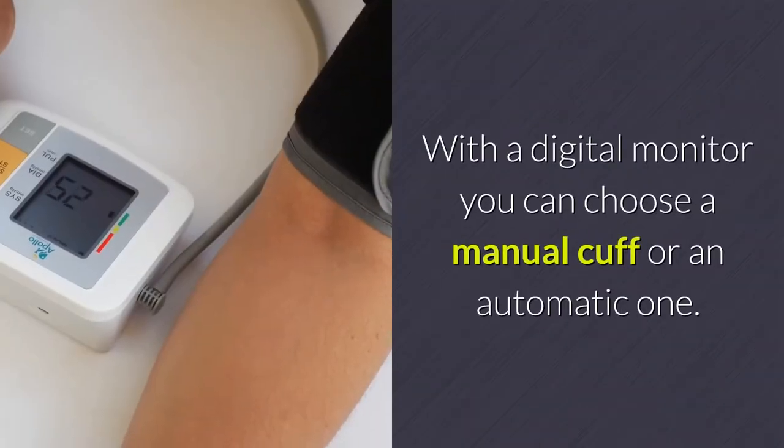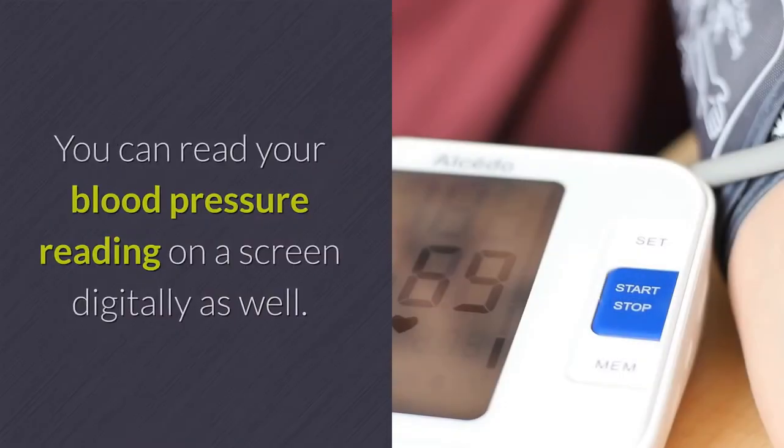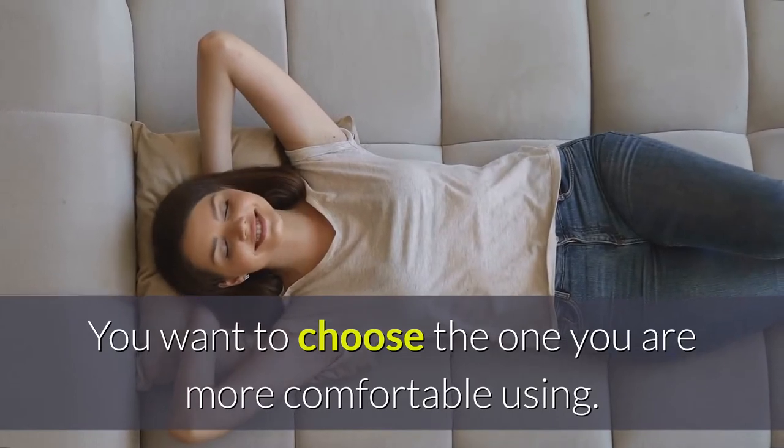With a digital monitor you can choose a manual cuff or an automatic one, and you can read your blood pressure reading on a screen digitally as well. You want to choose the one you are more comfortable using.